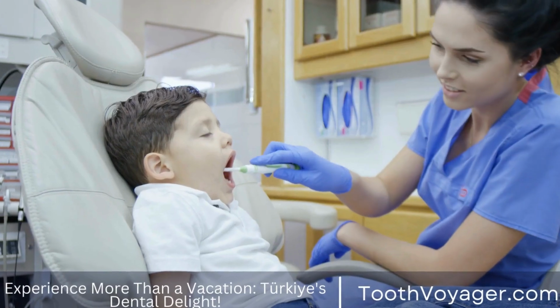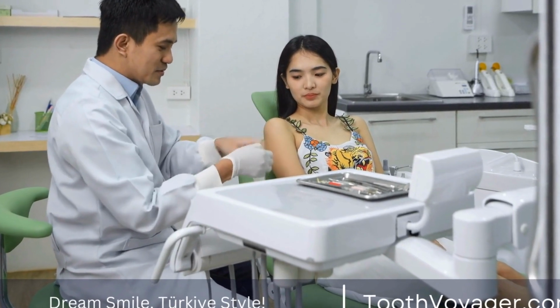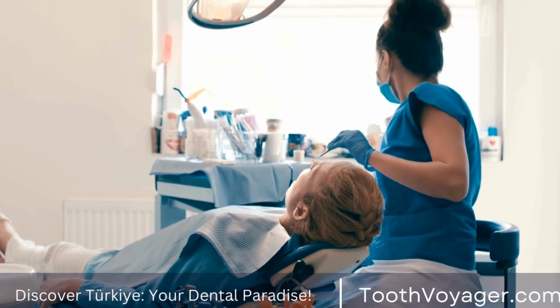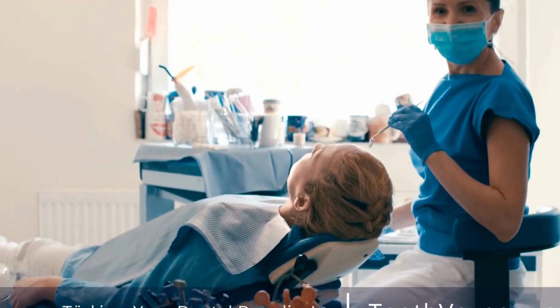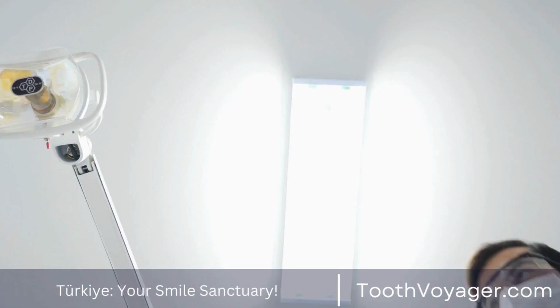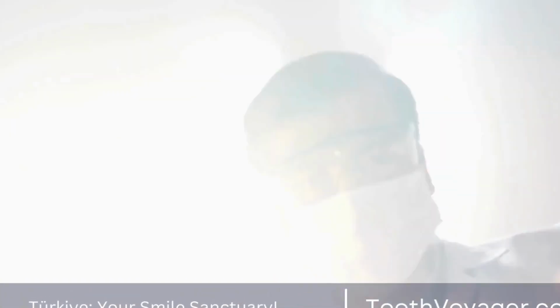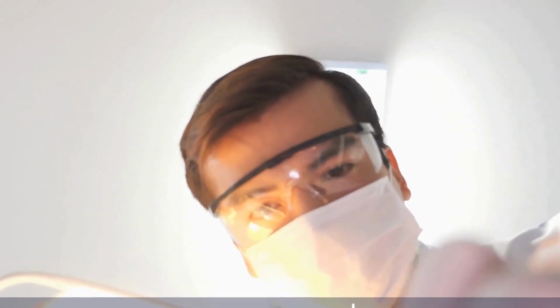Implant placement. After the treatment plan is approved, the next stage is the surgical placement of dental implants. The procedure is usually done under local anesthesia in order to guarantee the patient's safety during the entire procedure. Dental professionals will create an incision into the gum tissue in order to expose the jawbone underneath before drilling a tiny opening for the implant to be inserted.